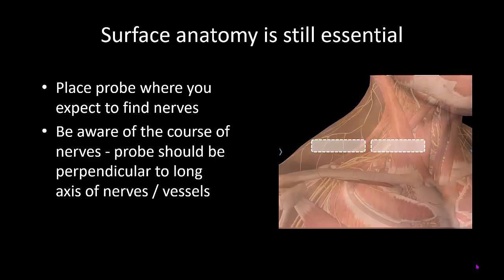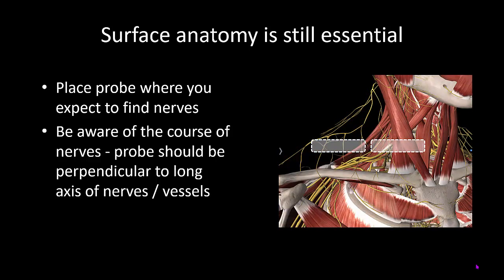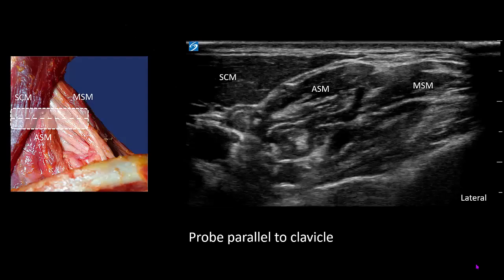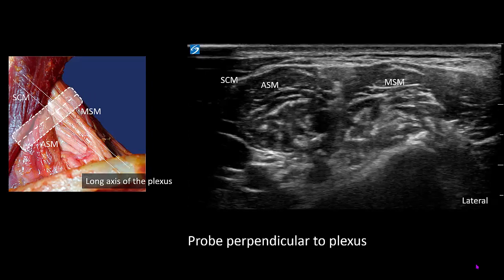This example of scanning for the roots in the interscalene groove illustrates this. If the probe is too lateral, you won't see any nerves, and if it is parallel to the clavicle, you may actually be oblique to the course of the plexus. This gives you a picture which is not what we usually expect to see. We are still over the interscalene groove between the anterior and middle scalene muscles, but we are oblique to the long axis of the plexus, and therefore the roots have this oval, stretched-out appearance. If we rotate the probe to bring it perpendicular to the long axis of the plexus, we now have the typical hypoechoic circles that represent the roots of the brachial plexus at the interscalene level, making recognition much easier.